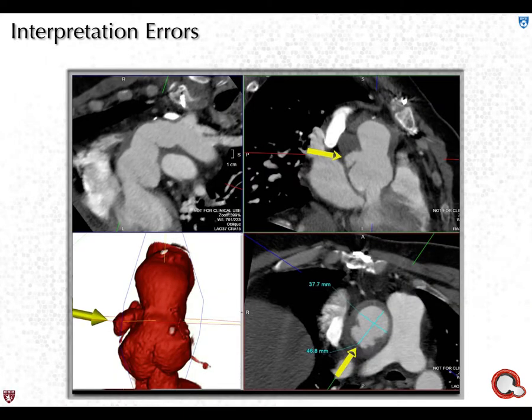Here's another example. This is actually the patient that I showed with the SMA thrombosis. This is the same patient. He had his repair done here. He left to go back to California to get his imaging done. These are the images that were done in California. The report comes back to Mark Bonacca, who's the vascular medicine cardiologist here. The report comes back with a penetrating ulcer in his ascending aorta. Now this guy doesn't have any ascending aorta left. It's all been replaced. So the people there weren't aware of his repair and his condition.